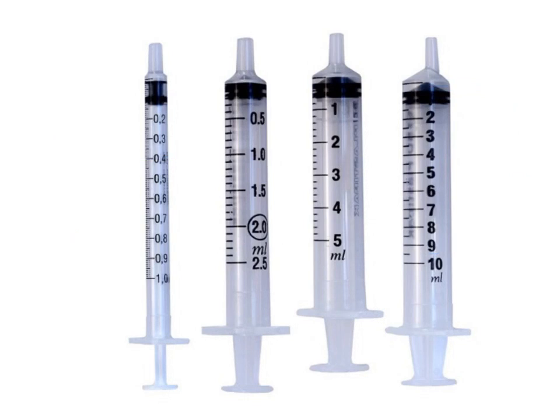So the way that you guys are going to see these listed, for instance, we've already seen this 1 milliliter syringe. I'll show you guys a better picture of that in just a second. But what you're looking at in this second syringe right here, this is only a 2.5 milliliter syringe. This is common with our 3 milliliter syringes as well. But you'll notice that, in comparing the two syringes right here, I'm looking at the difference between those two.